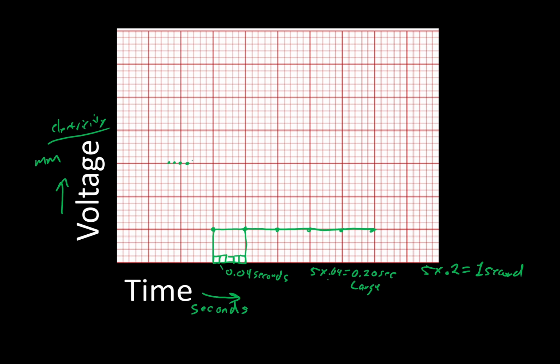So if we're going along and then it measures a total positive electricity at that moment coming towards it, and then less electricity the second later, you wind up getting this little arch. And then if it measures nothing, you see nothing. And then all of a sudden, if it measures a lot of electricity moving towards it, every millisecond, just more and more, and then it measures a little less, and then a little less, and then a little less. Now the electricity is actually flowing away from it, quite a bit actually. Well, the electricity is still flowing away from it, but there was less than a second ago.